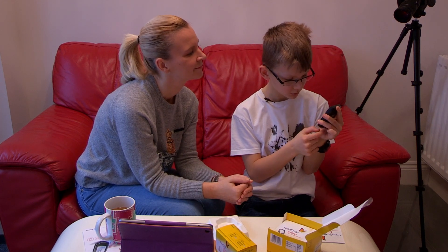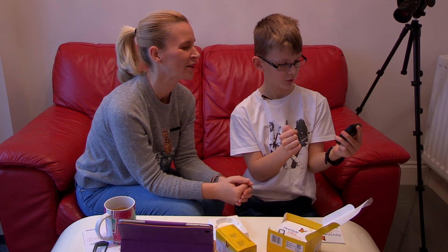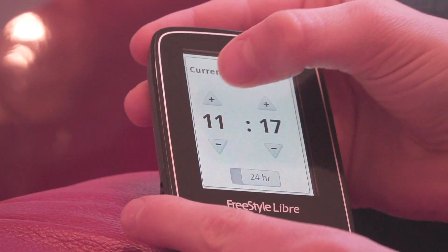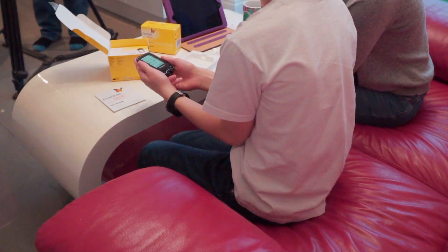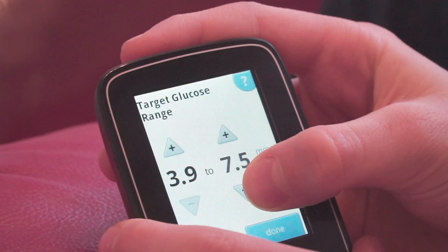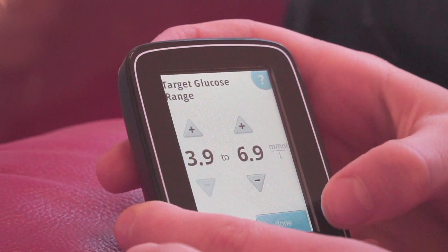It's a touch screen. Now you can set the time. This is the target glucose range — it says 5.6 to 7.8 by default, but mine is 3.9 to 6.9, so I'm going to quickly change that. How easy was that setup?